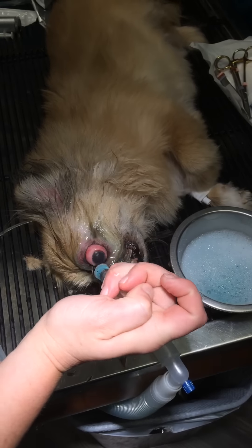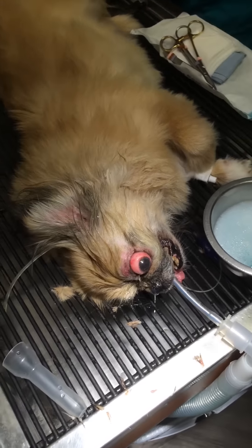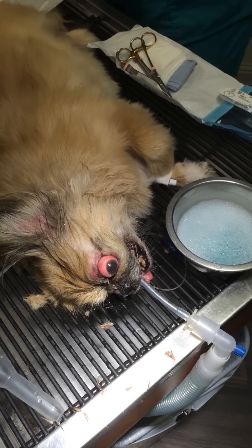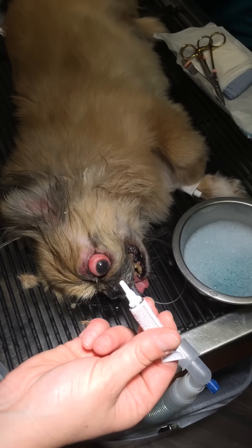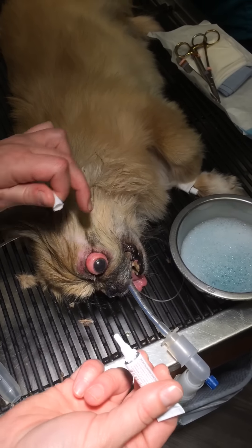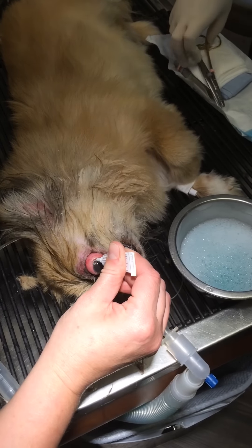This should be good. Where are you going to suture at? On the sides here, just like Tucker's eye technique — close the whole eye together.